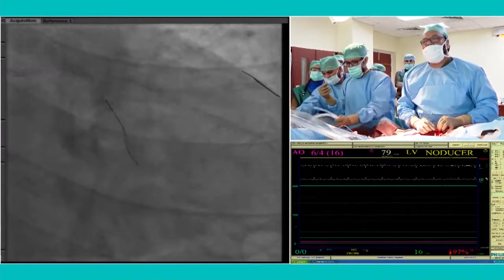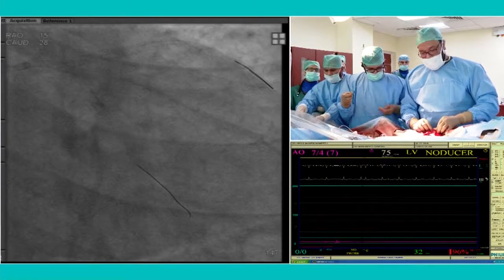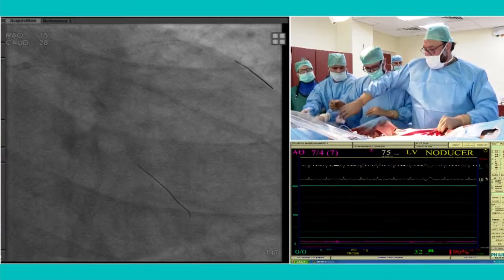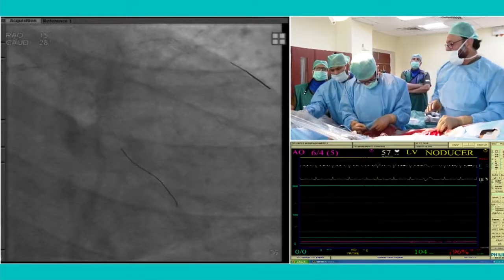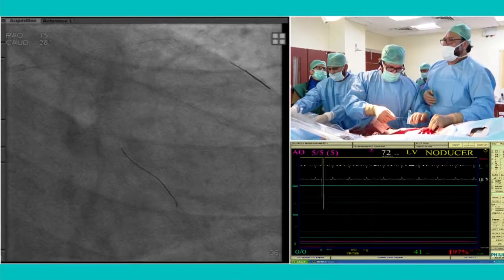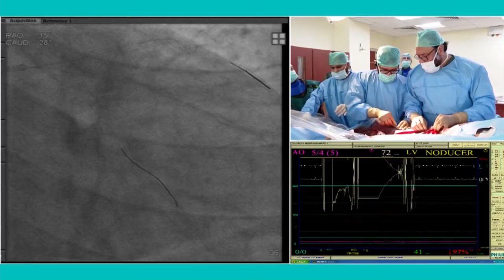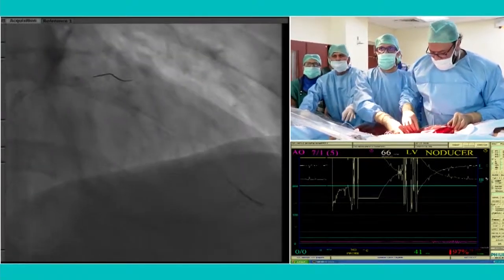This is the LAD. Can you wipe it, sir, please? Yeah, this is the LAD. IVUS ready? Okay. We just take a run from the proximal LAD into the left main only. Okay. Ready? Holding. The wire of circumflex.